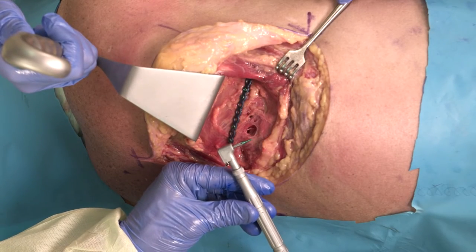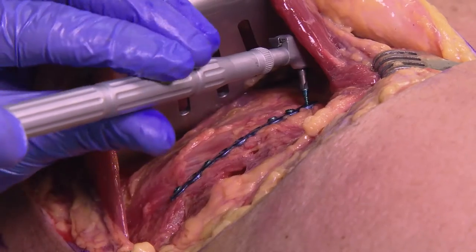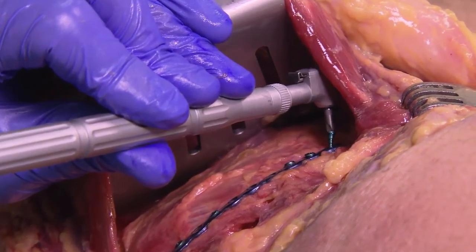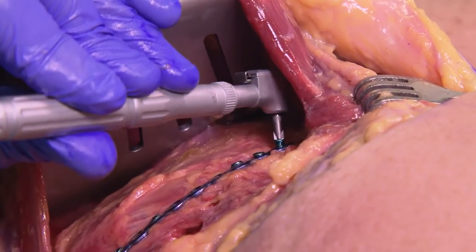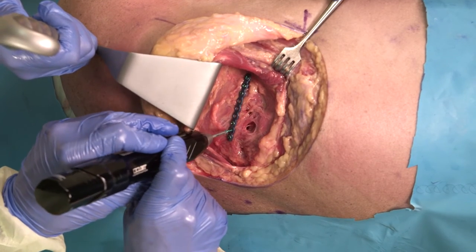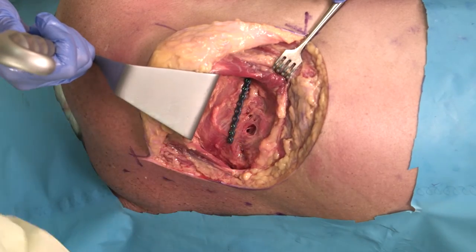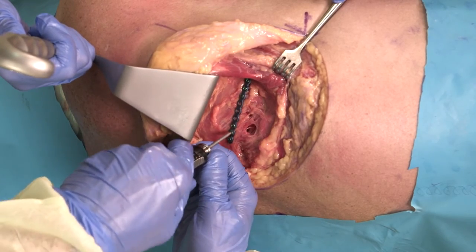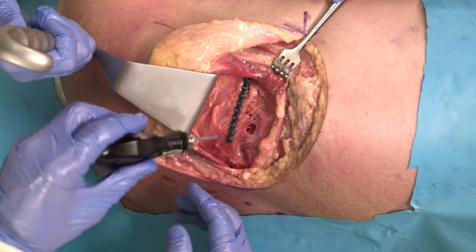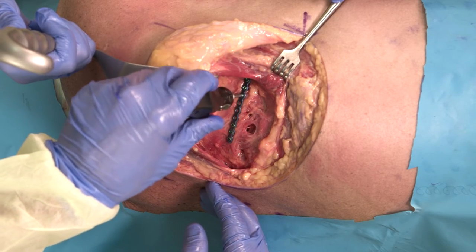For areas underneath the scapula, the right angle screwdriver can be utilized. This should be placed perpendicular to the screw insertion and then turned into position. A gentle downward pressure is applied on the mid-shaft of the handle and a torque twist applied to the end to advance the screw into position. A final screw can be placed posteriorly — one needs to make sure you're staying fairly perpendicular to the hole as you advance this, to allow the locking mechanism to work. Final hand tightening with a manual screwdriver should be performed, typically involving anywhere from a quarter to a half turn to achieve final tightening. Manual tightening with the right angle screwdriver can be performed in tight spaces, but final tightening with a straight screwdriver should not be attempted if the appropriate angle cannot be obtained.